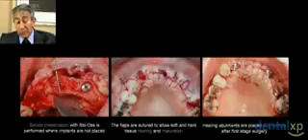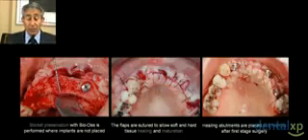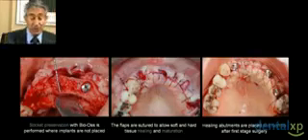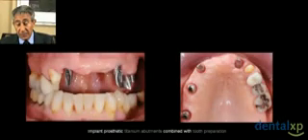And when we want to sound the bone, as we explained at the beginning, it is important to sound the bone after extraction. We can detect bony fenestration on the socket of tooth number 12. The periodontal teeth were extracted and the full thickness flap is reflected.